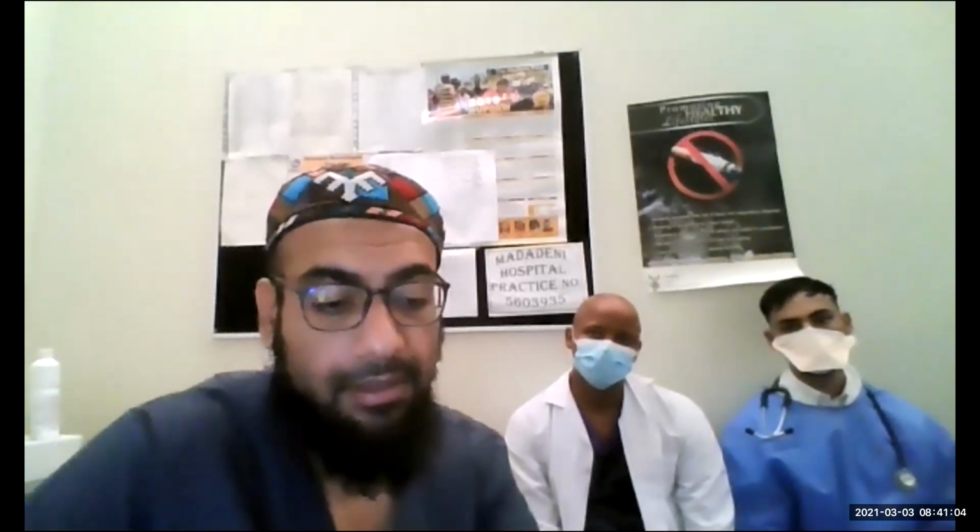Then what they say is that if that number you get is less than 25, your patient is, let's just say, fluid loaded, not fluid overloaded, all right? And if the number comes out greater than 75, the patient needs fluids, all right?